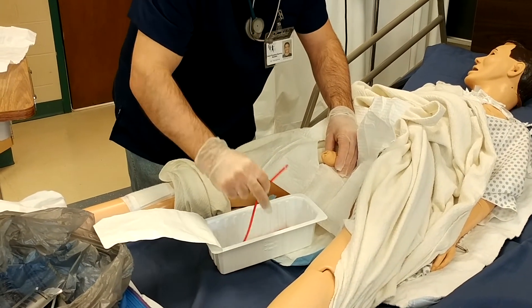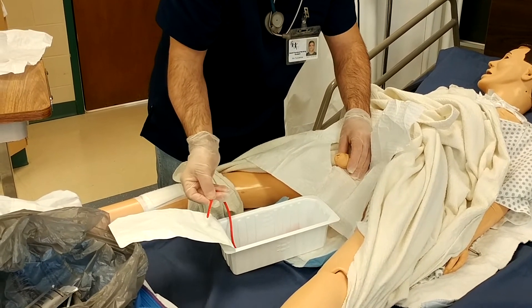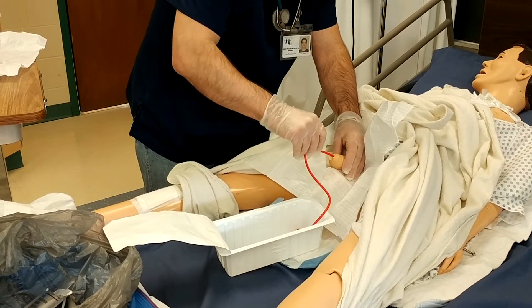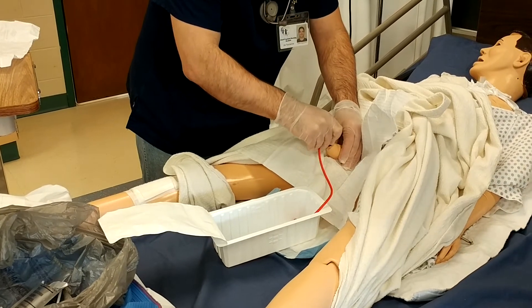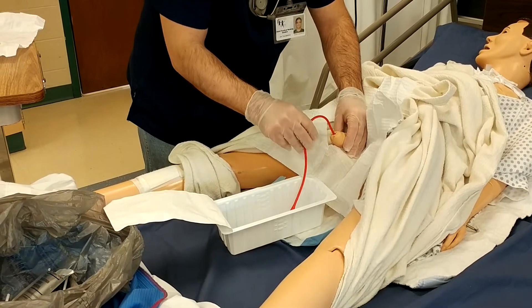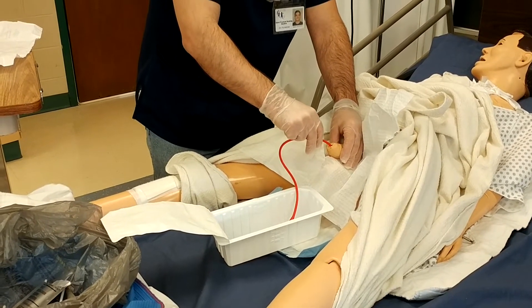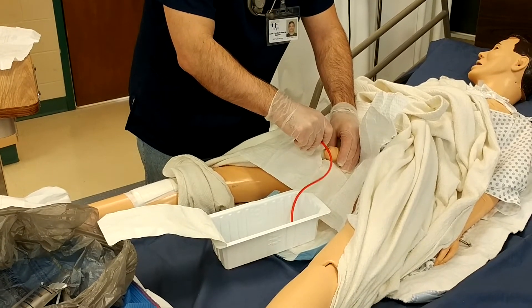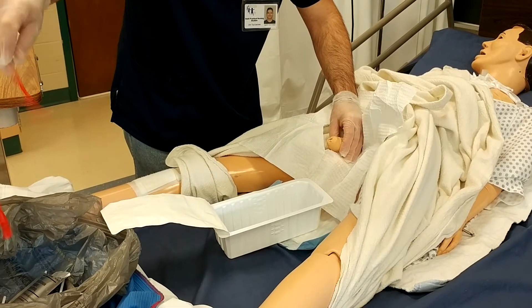So now I've got it pinched off. Now I can unpinch it, and I see urine flowing in there. When he is done — probably in about 10 seconds — I'm going to pinch it off again. Then I'm going to remove it and throw it out, because I don't need it anymore.